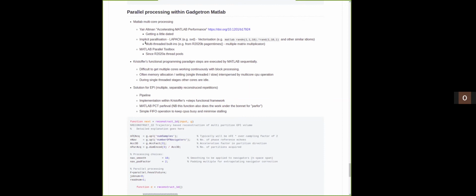And there's a sort of trend, finally, after about a decade of people complaining about things being slow, Matlab just put in another random function to make it faster. But Matlab also has the parallel computing toolbox, and finally that has thread pools, so you don't have the huge overhead of copying data between processes, but data can be shared by shared memory between the different threads.